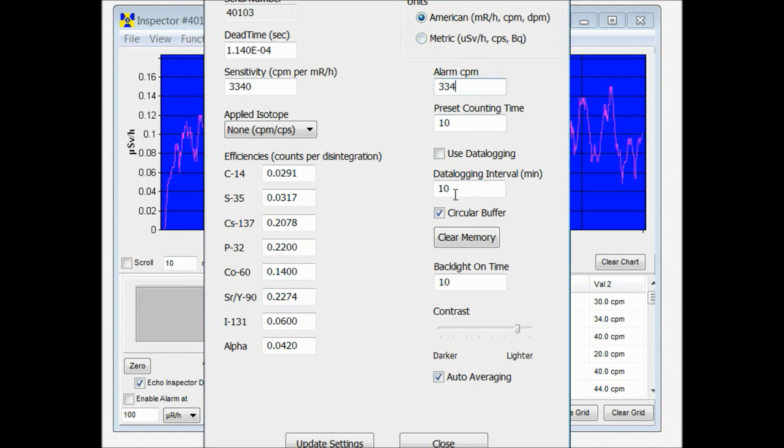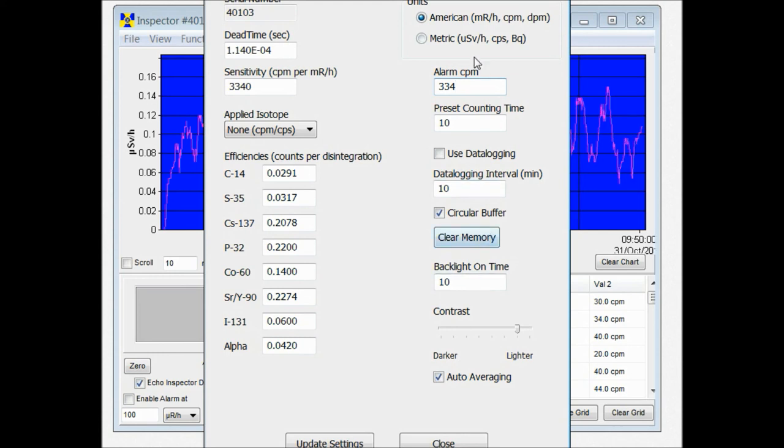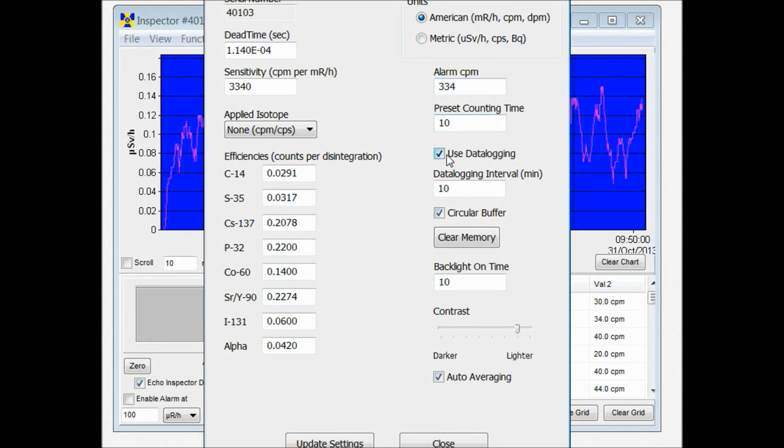You can also turn on data logging. You can turn on your backlight but you can't set the time. So this side of the panel here lets you change a few of the features. You can change your units of measurements. You can set your alarm here.